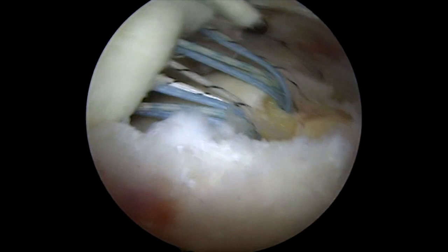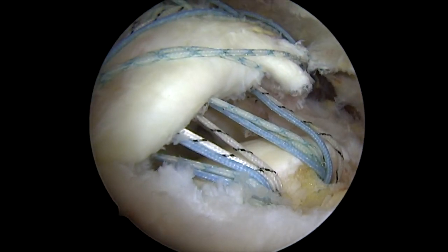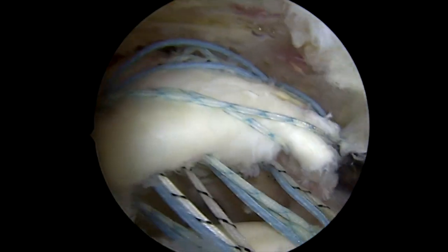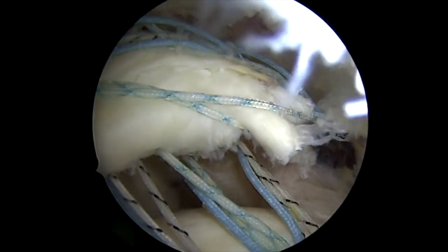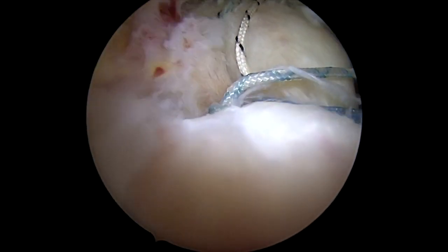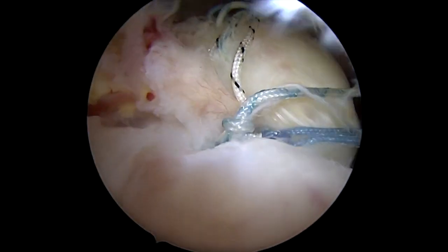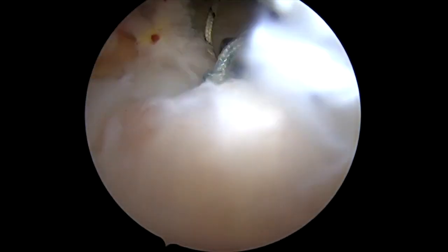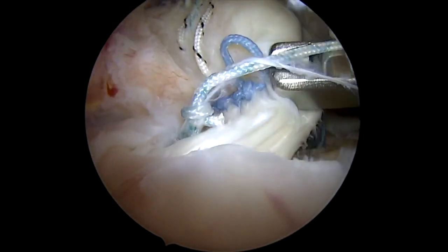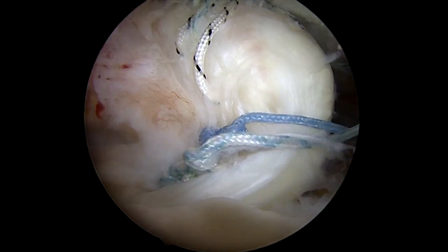You can see the sutures coming from the anchors up through the tendon and out the front. I'll then grab each suture individually out the side so I can tie them together, which will bring the inside of the tendon down, and then there'll be an outside edge that we'll fix later. So I've already tied one knot and I'm tying the second knot here. You can see this thing called a knot pusher coming from the side so that I can tie a knot inside the shoulder. Then we'll cut one of those sutures and bring that suture out the top from where we put the anchors in, so that we can get it out of our way.